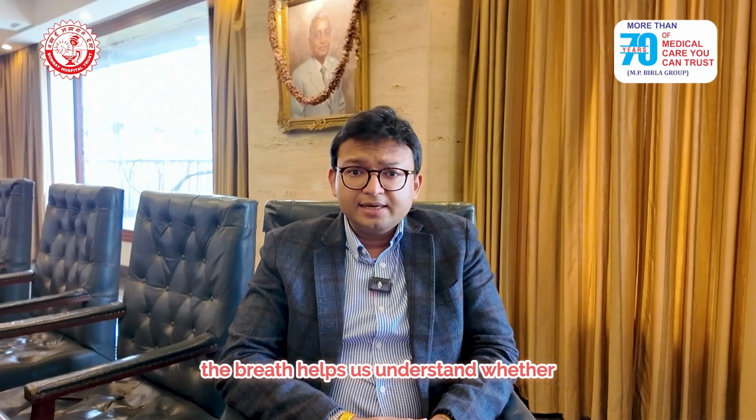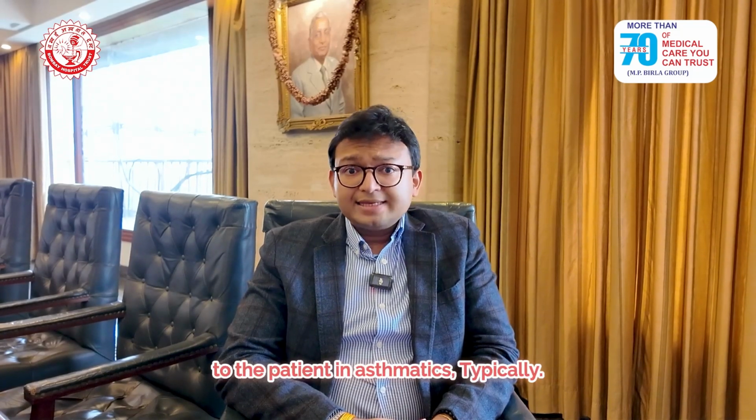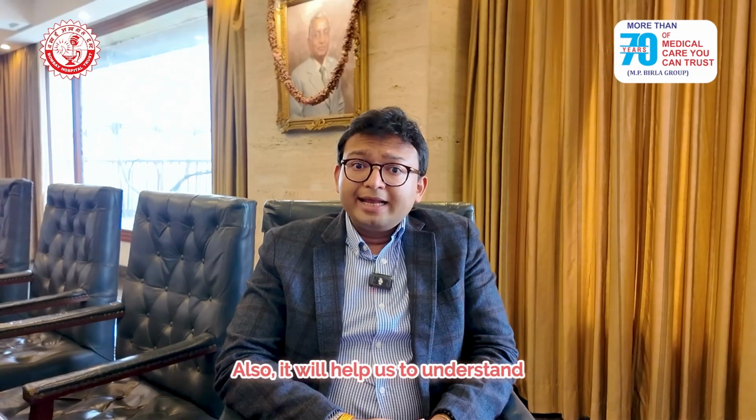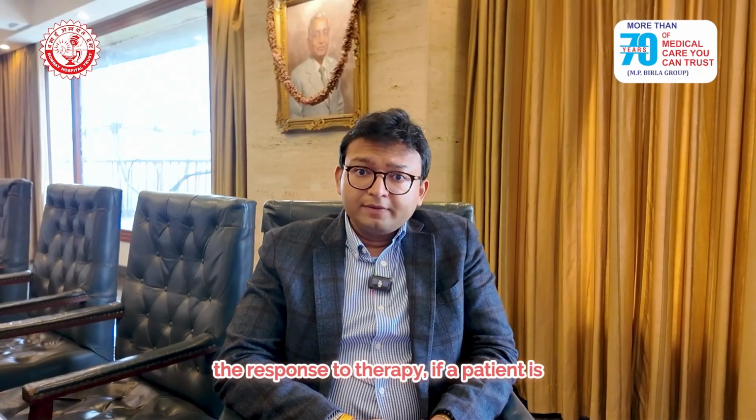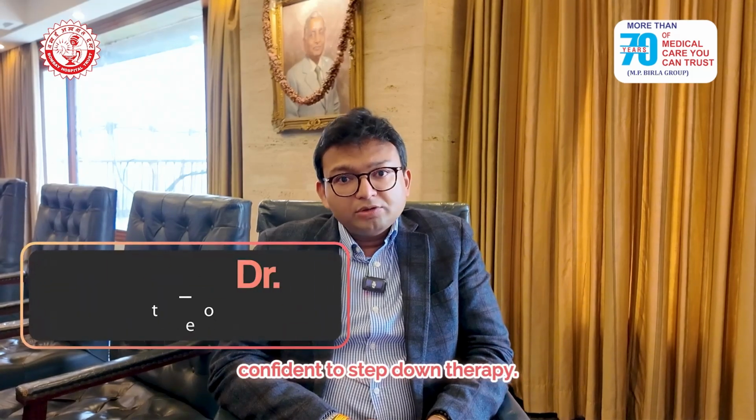The level of nitric oxide measured in the breath helps us understand whether inhaled corticosteroids would be beneficial to the patient, in asthmatics typically. Also, it will help us to understand the response to therapy. If a patient is on a particular dose of inhaled corticosteroids, patient is well controlled, and the FeNO levels are downtrending, we are very confident to step down therapy.